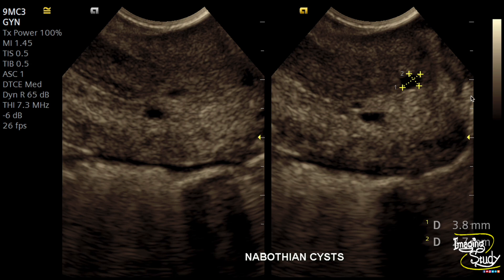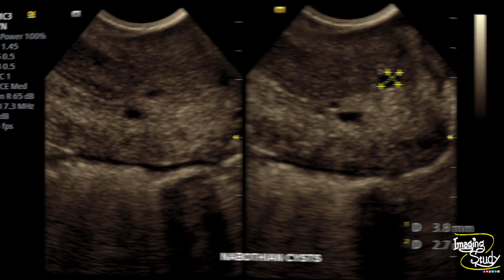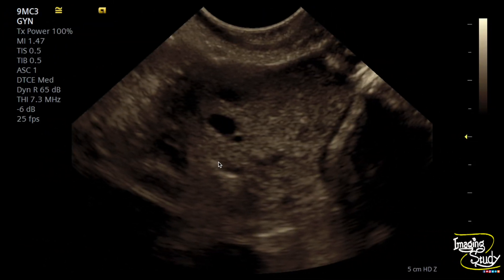Here's the measurement of the Nabothian cysts. If you magnify the image, then you can see many more of them. Again, the picture of the cervical Nabothian cysts in transverse section.